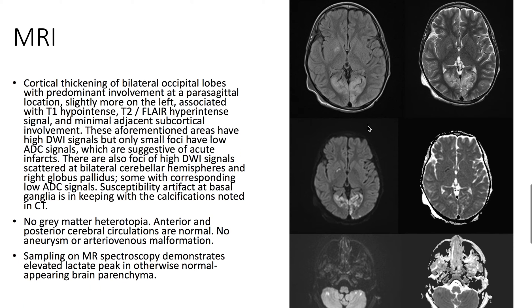On MRI, we see cortical thickening of the bilateral occipital lobes with predominant involvement at a parasagittal location, slightly more on the left, associated with hyperintense signal on FLAIR as well as on T2. The aforementioned areas have high DWI signal, but only small foci have low ADC signals, suggestive of acute infarcts.